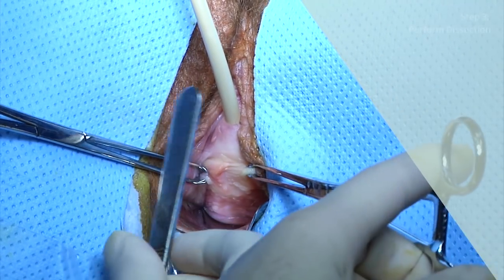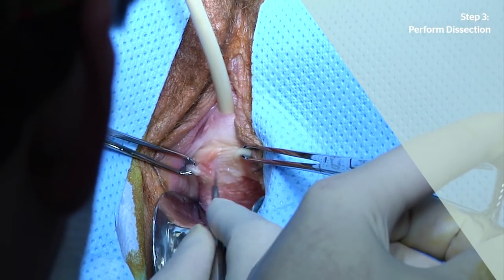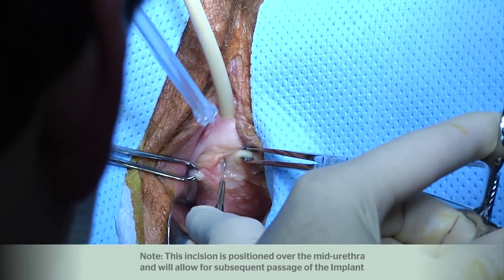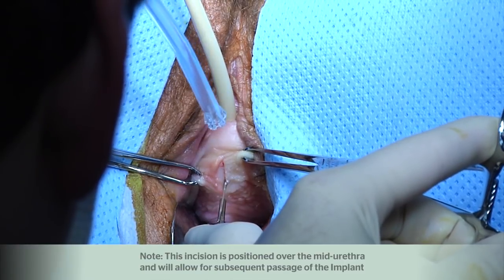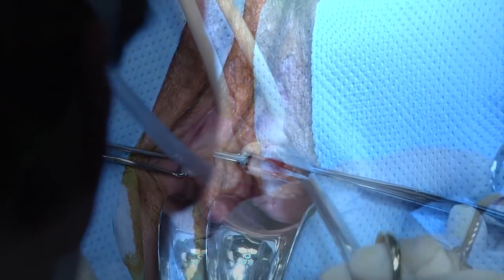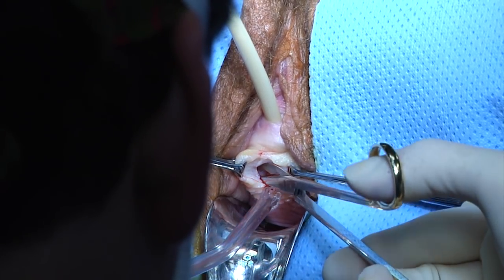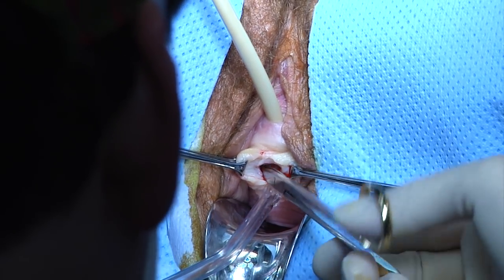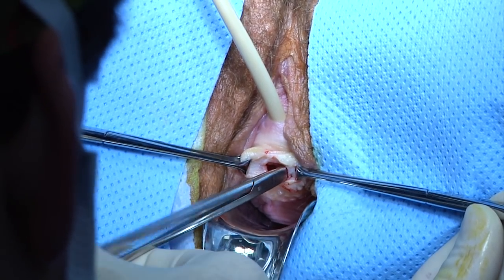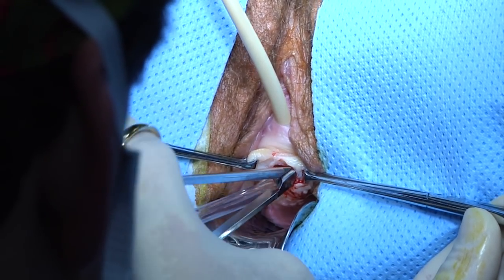Next, make a sagittal incision about 1.5 centimeters long, starting 1 centimeter cephalad from the urethral meatus. This incision will be positioned over the mid-urethra and allow for subsequent passage of the implant. Make 2 small 0.5 to 1 centimeter paraurethral lateral dissections between the vaginal wall and the periurethral fascia. These dissections will accommodate the insertion of the trocar sheath tips.